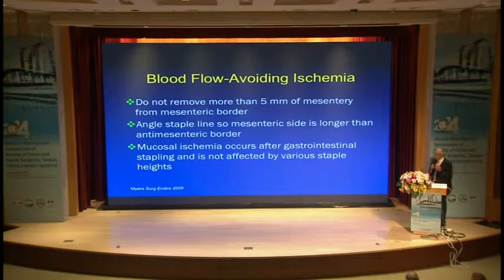And it's very important to respect a certain number of rules and not to be too close to the mesenteric border when you're peeling off, when you're trimming off the mesentery. You also want to make sure that your line of division or stapling does not go in the wrong direction. You want to make sure that you have a shorter end on the anti-mesenteric side as compared to the mesenteric side of the colon.